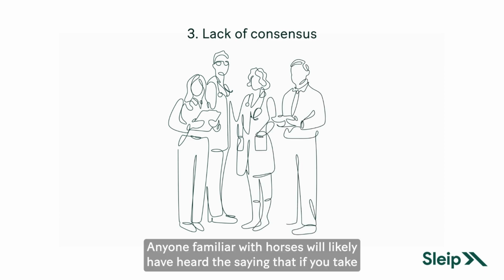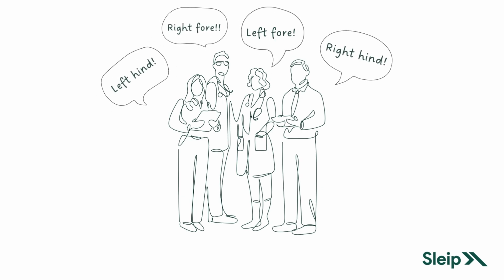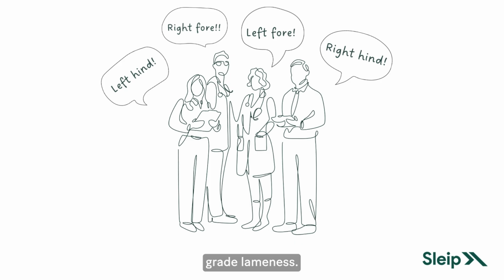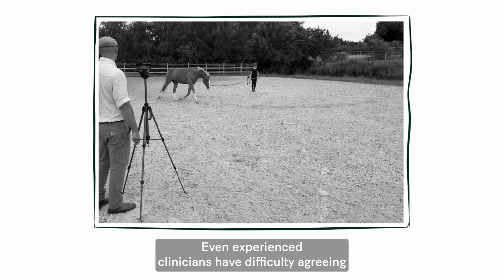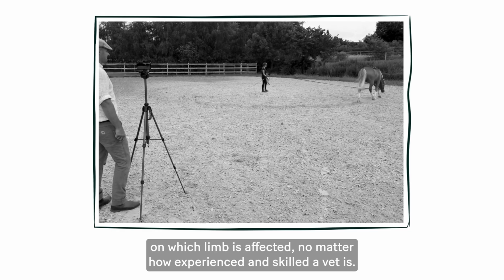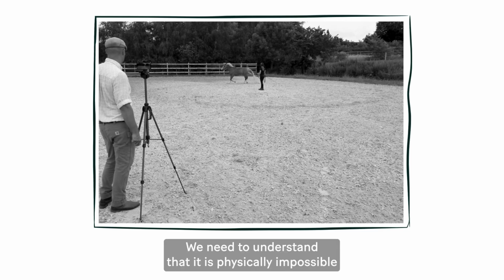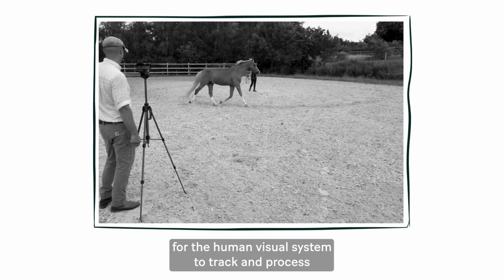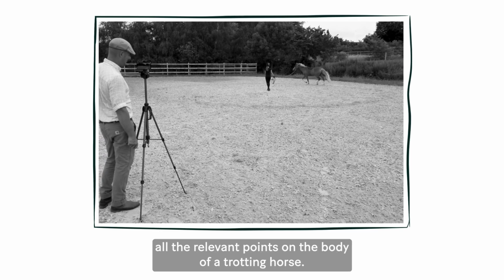Anyone familiar with horses will likely have heard the saying that if you take your horse to 4 different vets, it will be lame in 4 different legs. This joke holds some truth, especially in cases of low-grade lameness. When the lameness is subtle, even experienced clinicians have difficulty agreeing on which limb is affected. No matter how experienced and skilled a vet is, we need to understand that it is physically impossible for the human visual system to track and process all the relevant points on the body of a trotting horse.